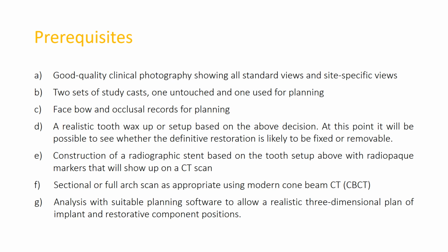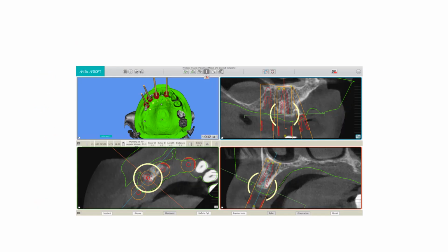So now, moving on. This is a CBCT that is used for treatment planning, surgical planning, and for patient education. Using CBCT, we can assess the bone density, bone width, bone height, the anatomical structures, and any pathology, and then we can plan where the implants need to go. We can even fabricate a surgical guide for the placement of the implant. Of course, not every case can be done using a surgical guide. And that brings us to the end of our lecture.